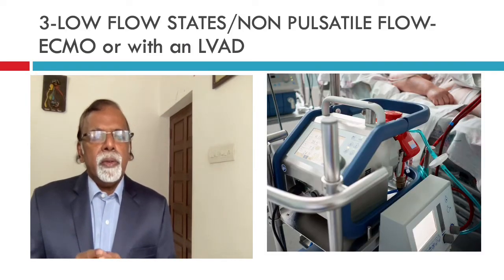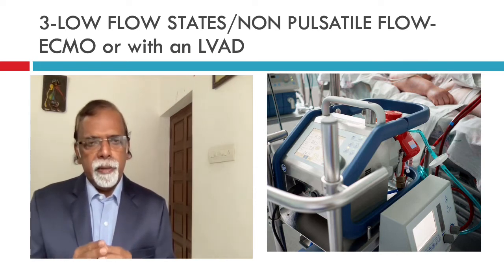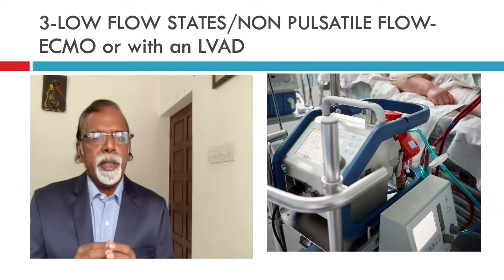In ECMO or left ventricular assist device, or patients with low flow states, blood flow is comparatively non-pulsatile and the values may be inaccurate.